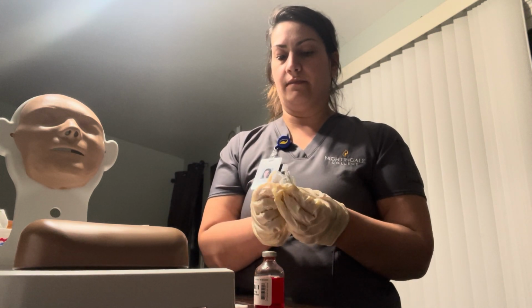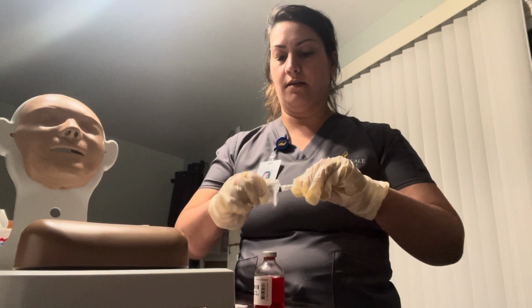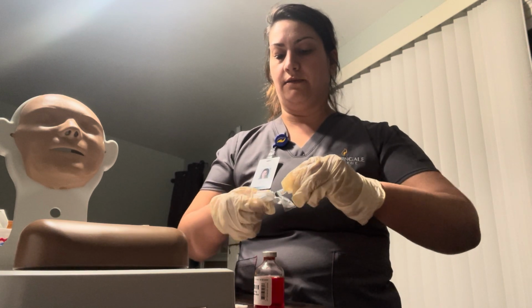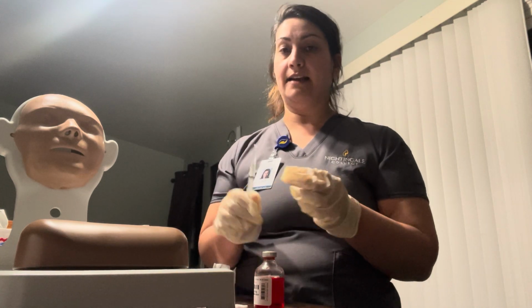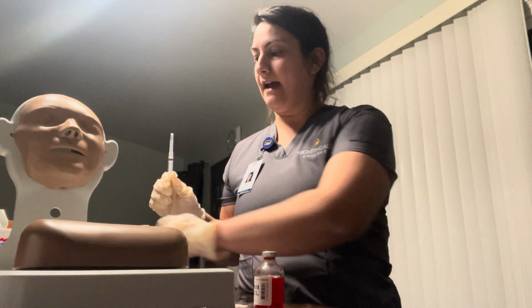Perfect. I'm just going to put it on. We're going to do that. All right, next, I'm going to toss that.